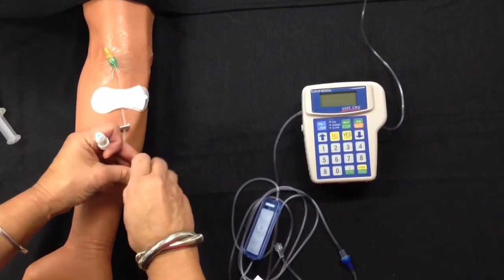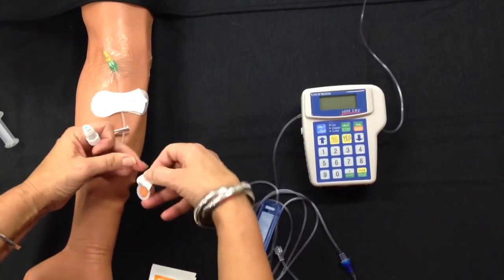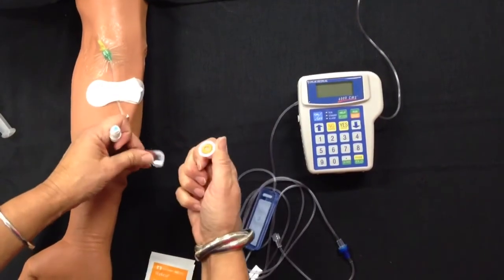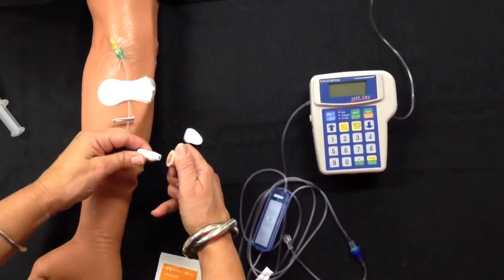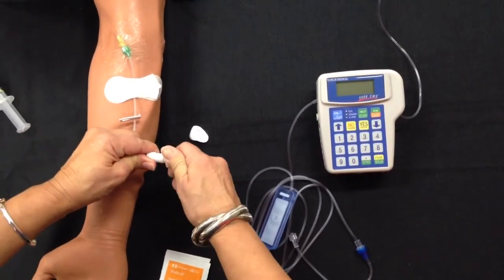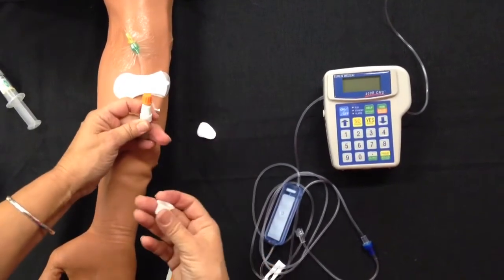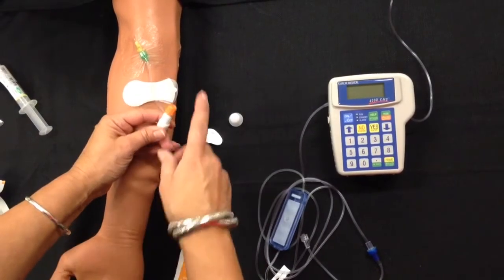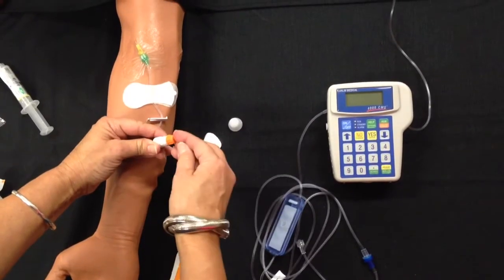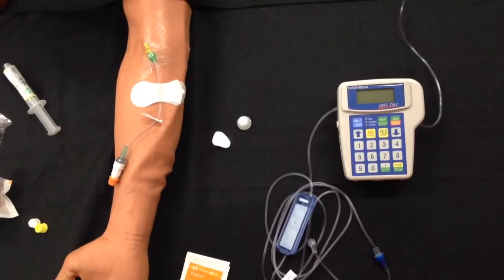Remove the top of the swab cap. You may need to line it up, and you may need to push, especially in the wintertime. It gets a little hard. It will fit. Push hard and remove the plastic covering. These will protect your line from germs from your skin getting on the end of it and will reduce your chance of infection.